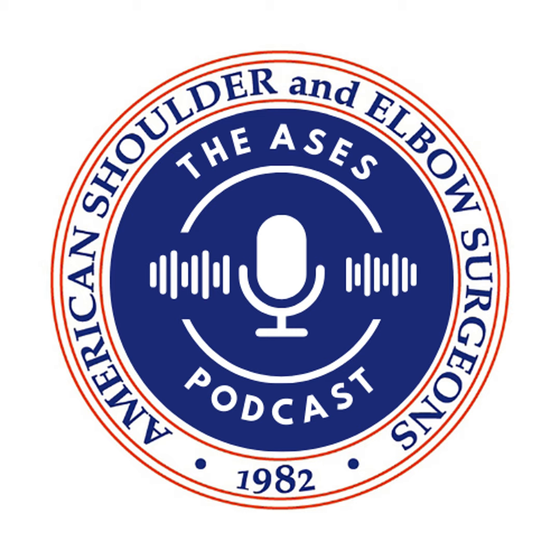Okay, what about you, Chris Klifto? Oh, Peter, we actually talked about this a lot, and I learned a lot of my technique from you. I use an augment almost every time for this patient, and the reason is not only do I want to correct the inclination, like Andy said, these like to, if they're going to dislocate, kind of dislocate lateral and superior. And the ones with the irreparable rotator cuffs, I get more concerned with for dislocations and rotator cuff arthropathy. So having an inclination built in with my wedge is the objective I'm trying to achieve.